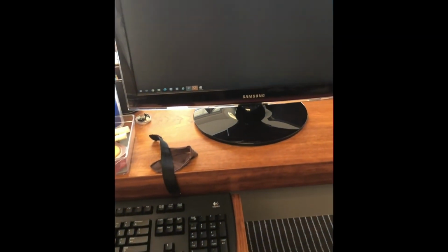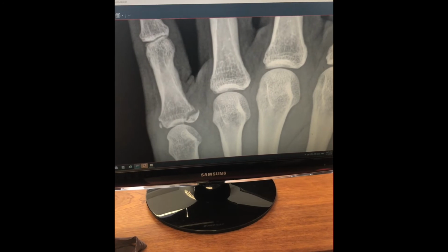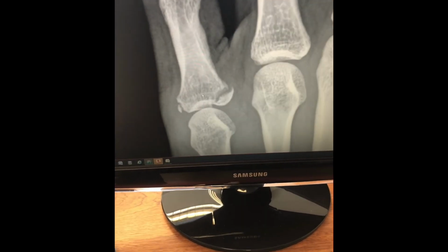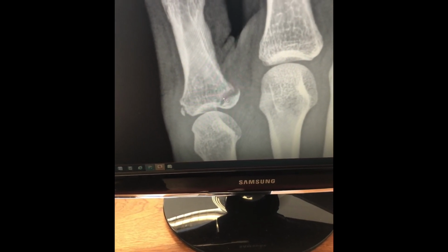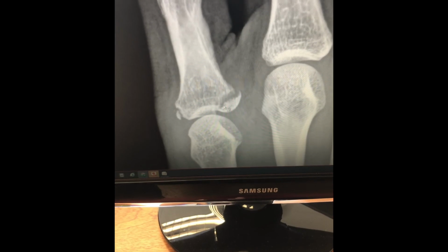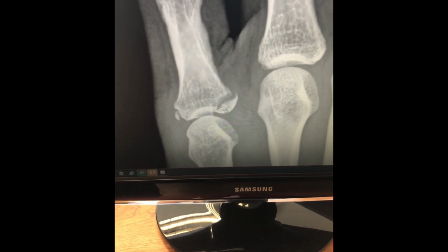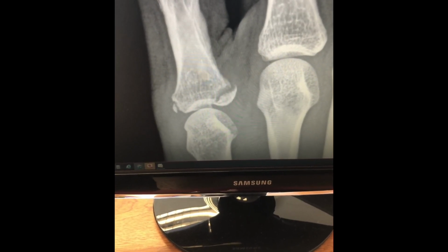What is interesting, though, is if you look at the X-ray now, you'll see a delayed union at 4 weeks, but this is completely non-tender, and it is in keeping with a typical hand fracture, which takes a while to show callus and complete bony union. So yes, you could argue that there's been displacement of this fracture, but I know from experience that this patient will do fantastically well with a full range of motion, no long-term arthritic problems, and she will likely progress to union. A repeat X-ray will be taken in 6 weeks' time just to confirm union.